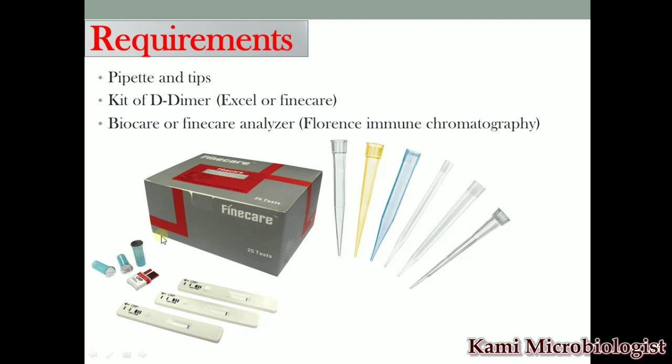Okay, once you have mixed it for 10 seconds, then what will you do? You have to take out 80 microliter. If you are using the Fine Care machine, Fine Care kit, you will take 75 microliter. Once you take the 75 microliter, you will put it into this well.